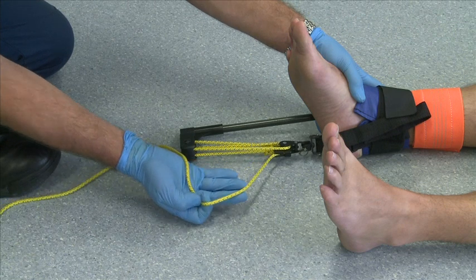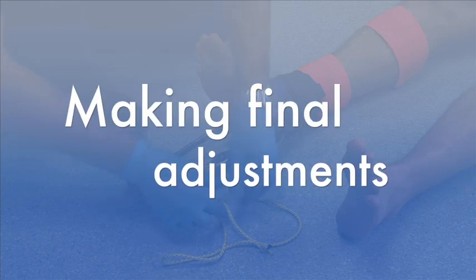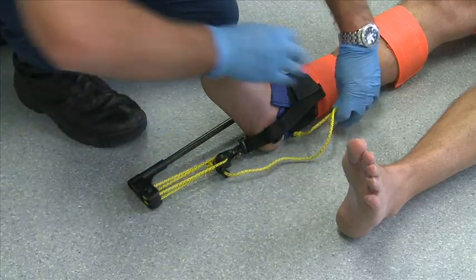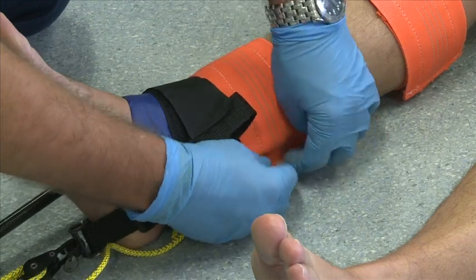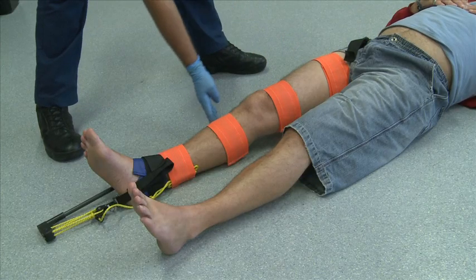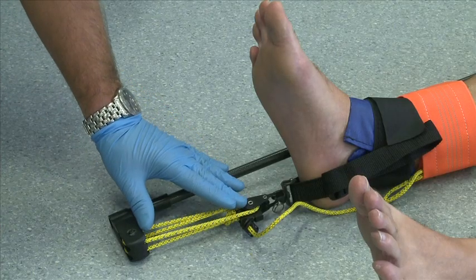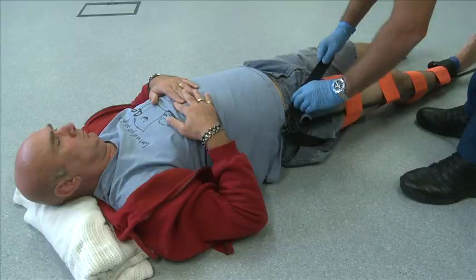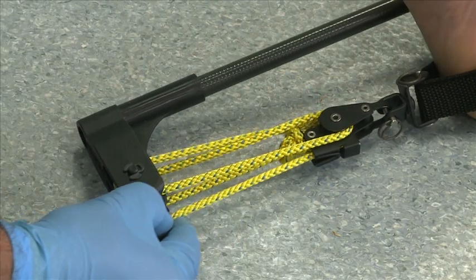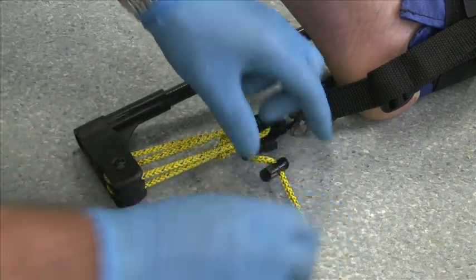Lift the line and re-lock it into the V-jam cleat. Step 10 — Final adjustments: tuck any excess line under the leg strap. Check the splint is correctly in place and achieving the desired results and make any final adjustments. The traction pulley can be shortened if needed by loosening the upper thigh strap, pulling on the loose line, re-applying traction as needed, and tucking any excess line under the leg strap.